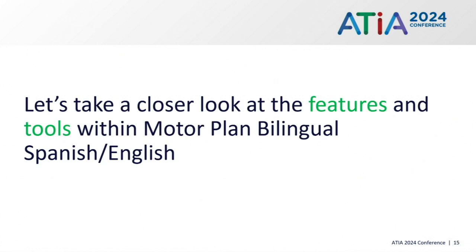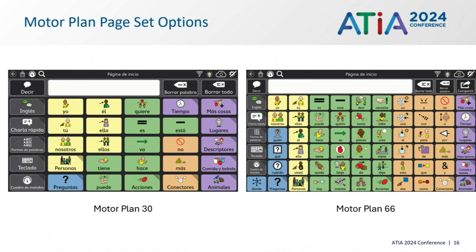All right, so we did a little bit of some background, and let's go ahead and jump into the features and tools within this motor plan bilingual Spanish-English page set. Say that 10 times over and you will get a workout.